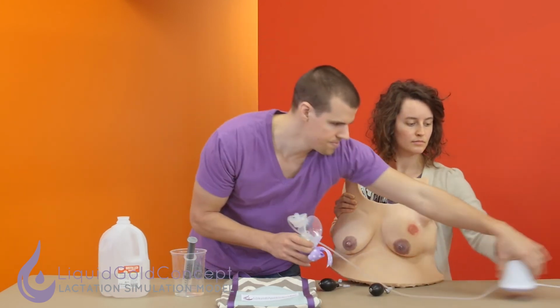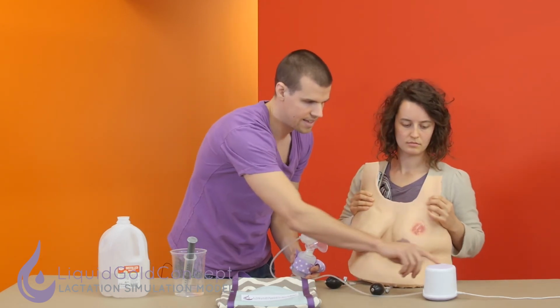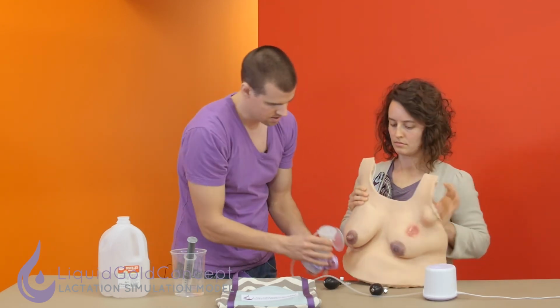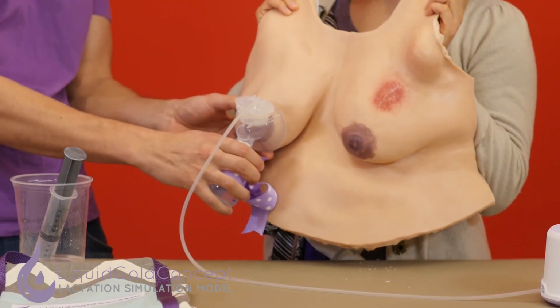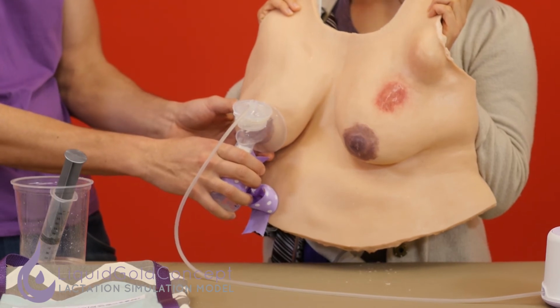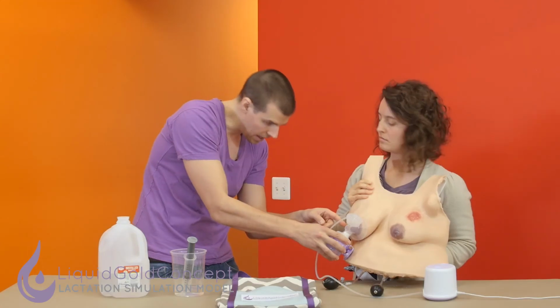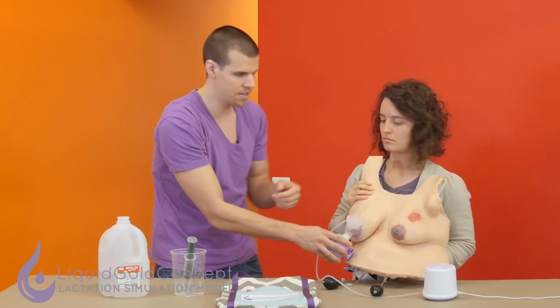The other way you can do this is by attaching a breast pump, which I have here. So we'll use this, we'll turn it on the highest setting and we can attach it to the nipple. And now we can see that the nipple is getting pulled into the breast pump and I can see some water starting to come out. So we know this one is also primed and ready to use.